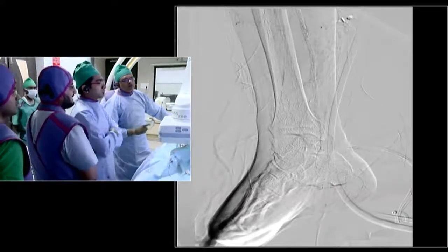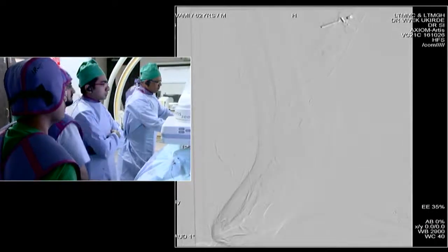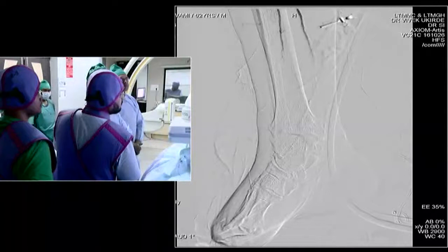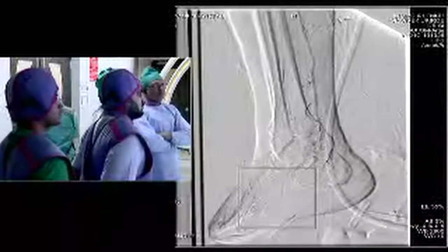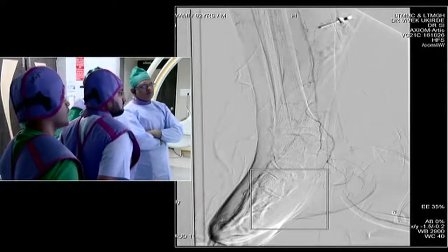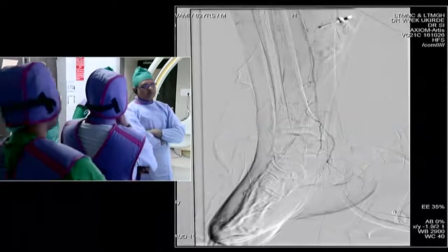Probably we will have to touch the lower end to get the posterior tibial flow to improve. Another thing I look at is the flow in the other two arteries — how fast they are going down. The artery that you have angioplastied should show rapid flow equal to or faster than before, then you know you've done well. Dr. Vimal, do you think we should approach the plantar right away in this session? I think so — if you take a smaller balloon through the scaffold, it will slip through the stent and you can go down and open up the plantar branch.